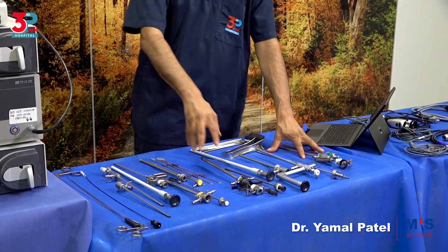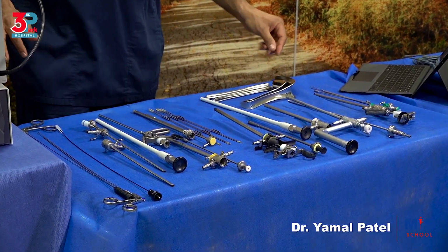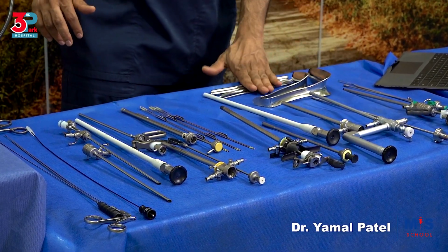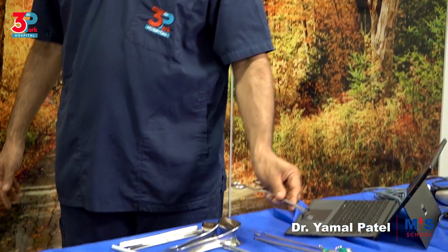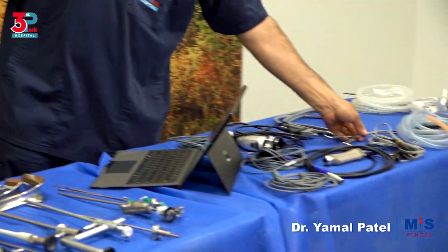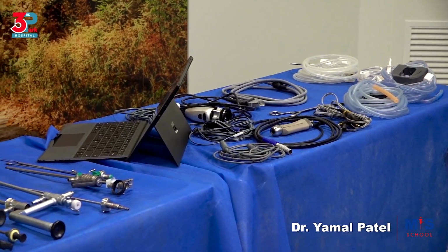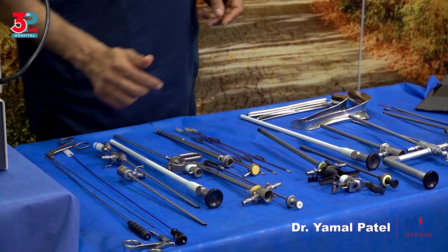We have a resectoscope. These are instruments. And we have operating instruments, along with the regular D and C set, where you'll have a speculum and maybe dilators and a vulsellum sometimes to hold the cervix. So this is how you would set up a hysteroscopy trolley. And these are the operating instruments. We'll go into them one by one as we move on.